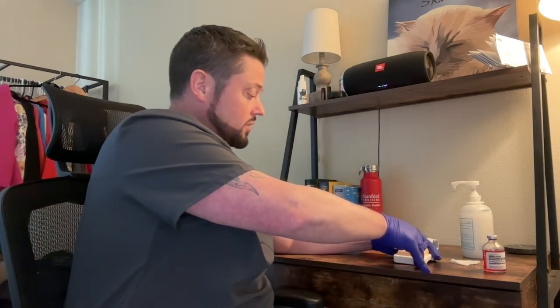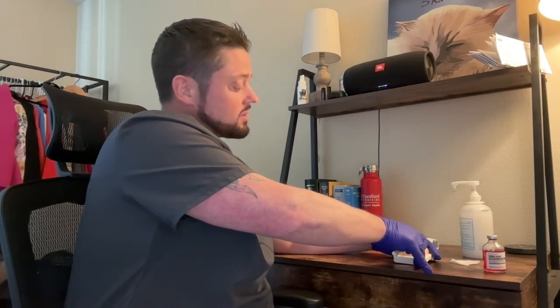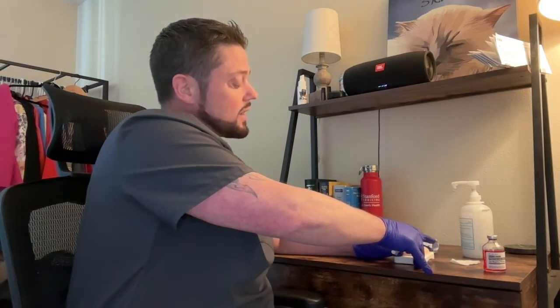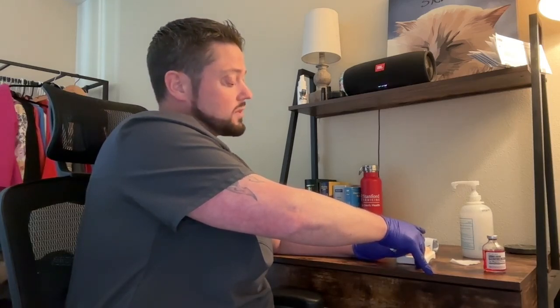We're going to insert our needle slowly, advancing it approximately 3 millimeters under the skin, looking to see the presence of that needle. Once we are in, we want to feel slight resistance. We're going to grasp the top of the syringe and hold that in position with our non-dominant hand, and we will slowly inject our medication. We want to notice a small 3 to 6 millimeter bleb forming at the injection site. It should resemble a mosquito bite.